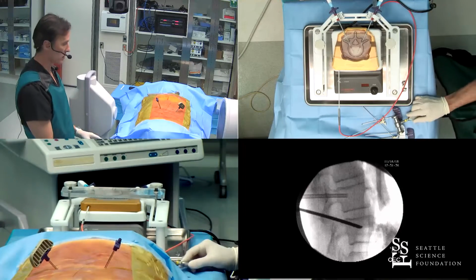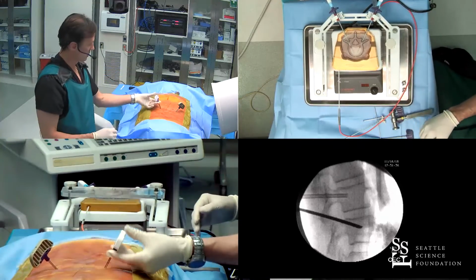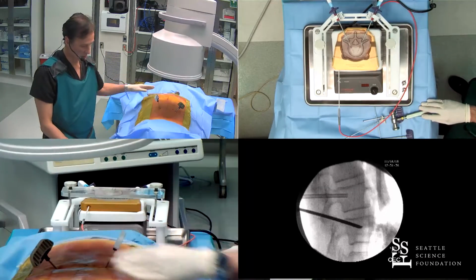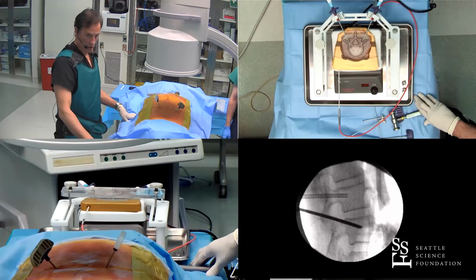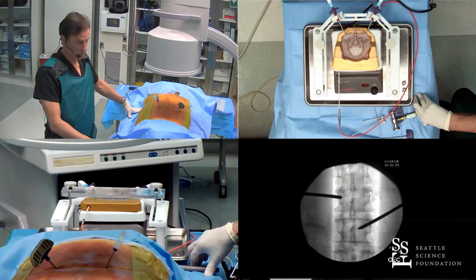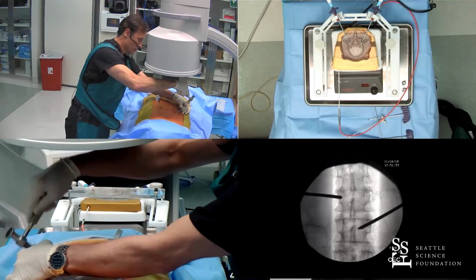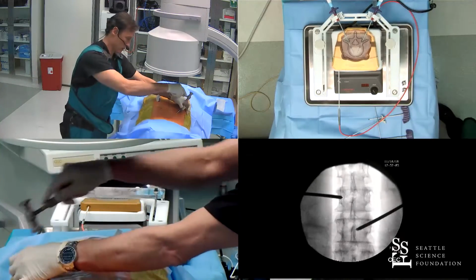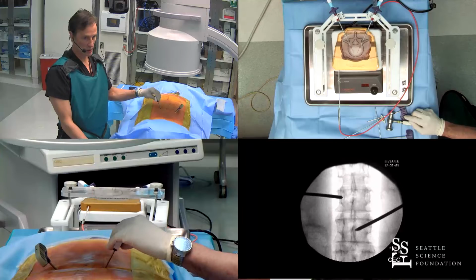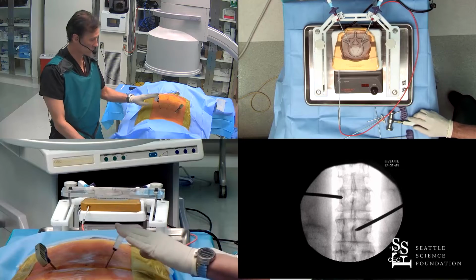So we're kind of right in the middle, and we're going to come back around and take an AP shot, and we'll see the difference between the transpedicular approach and the parapedicular approach. So this way, we're more toward the center of the vertebral body, almost dead center. We could just give it a couple more taps to put it in the center portion of the vertebral body. And this is the transpedicular approach. Above it sits quite a bit more ipsilateral. So transpedicular, parapedicular.